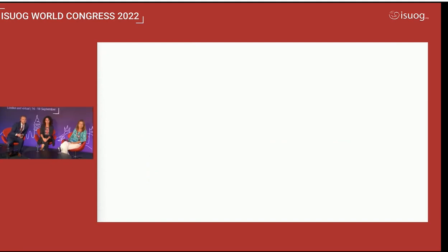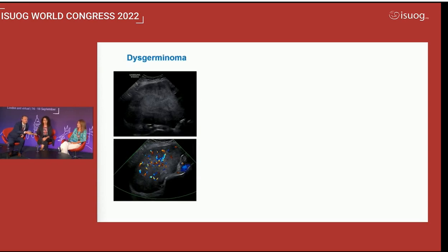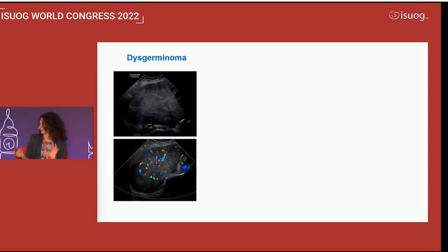I think we are running out of time, so Chiara, do you want to summarize? Yes, if we have to just say a few words regarding dysgerminoma, I would say unilateral solid with septa, young patient, not menopausal, 25, 16 years old, etc. LDH, alpha-fetoprotein, and that's it. Yeah. HCG can also be increased. Yes.